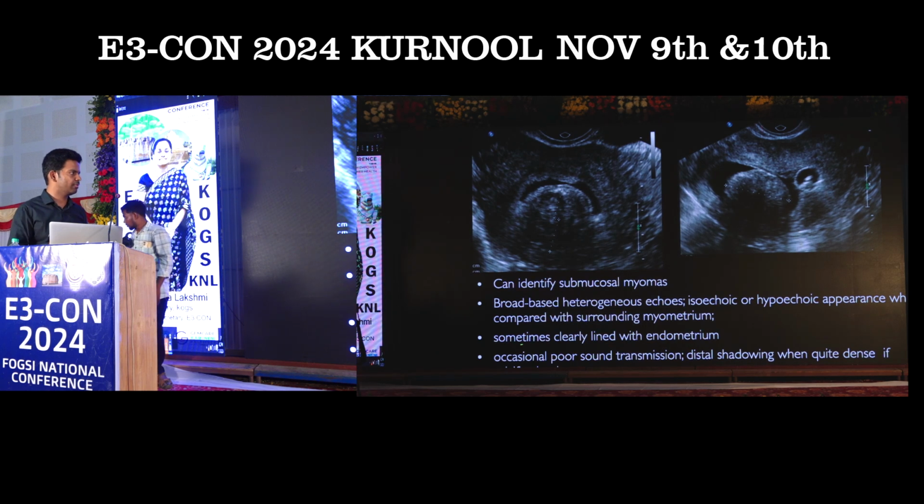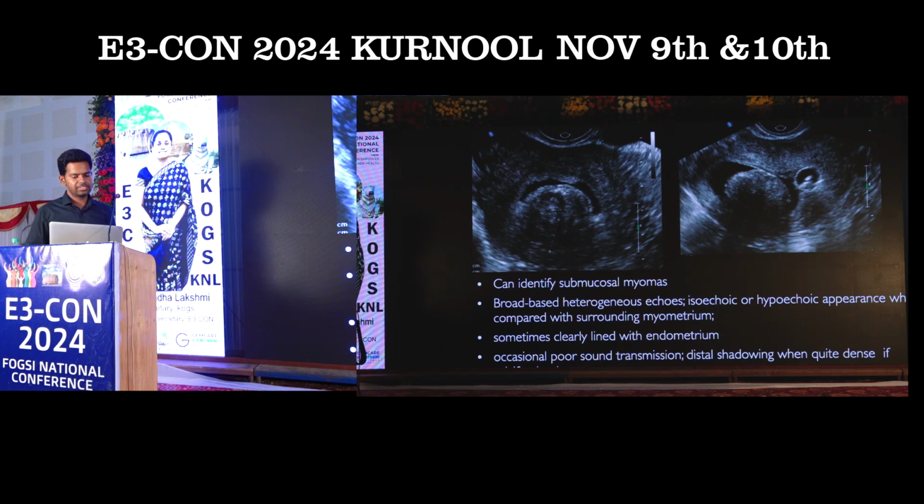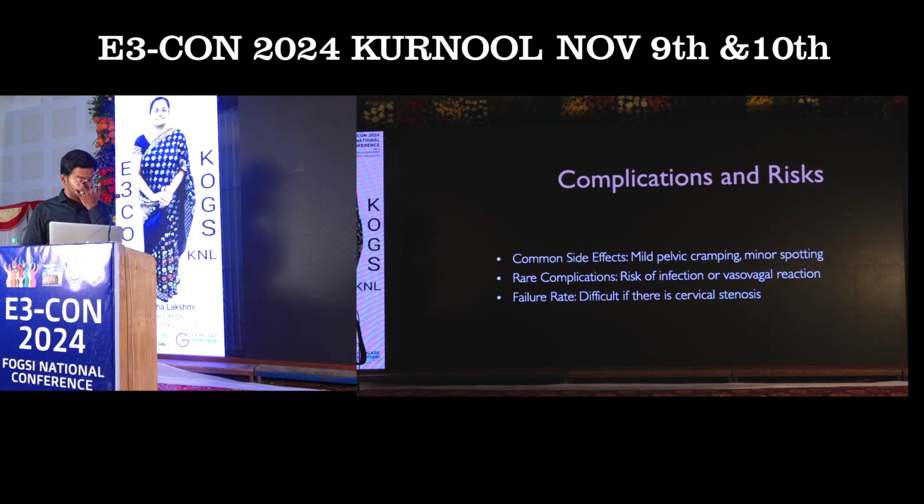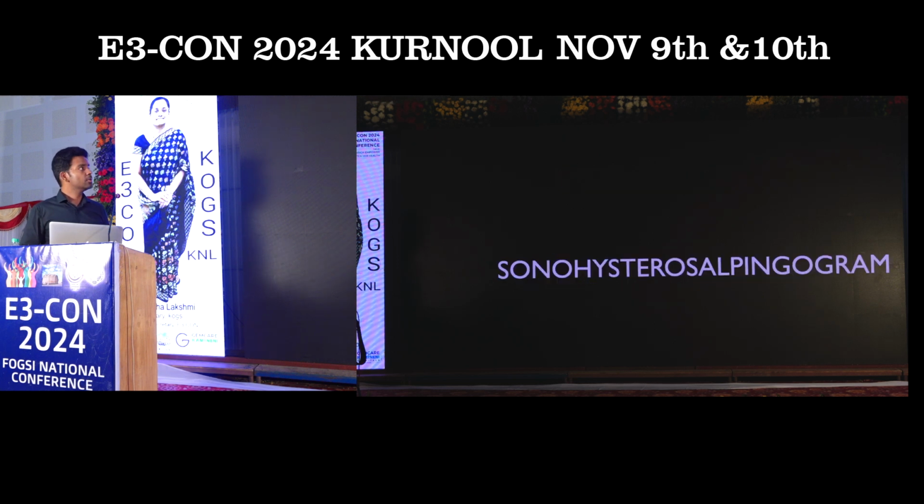So this will also help to identify a submucosal fibroid, where it will be broad-based and will be lined clearly by the endometrium. And sometimes when there is dense calcification, we can see poor sound transmission because of dense acoustic shadowing. Complications: generally this procedure is well tolerated, with minor spotting and minor pelvic cramping.